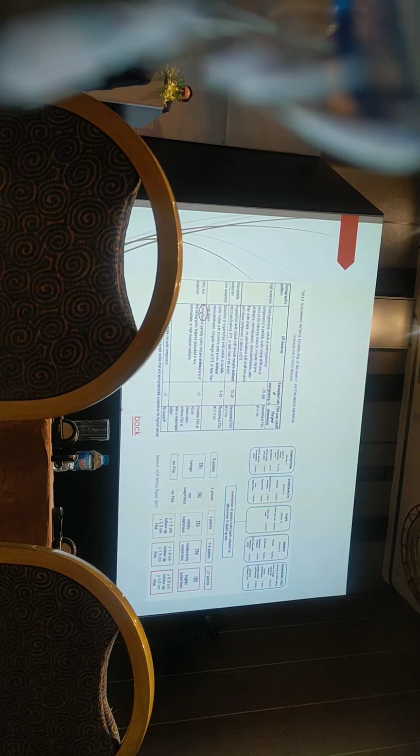If the size is more than 2 centimeters, they recommend performing a biopsy. But in the TI-RADS guideline, in the spongiform composition, they think this is a benign lesion and it is not necessary to perform a biopsy.